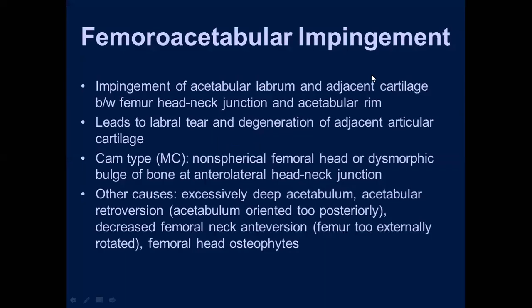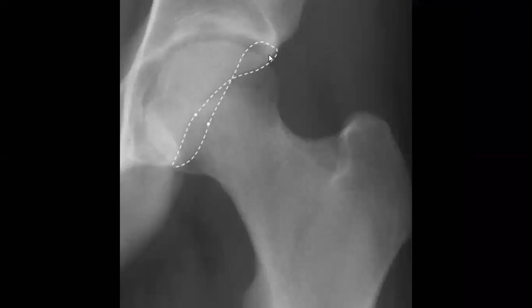We mentioned this one about the types of femoroacetabular impingement, which has cam type and pincer type, right? And when you find the junction between the head and neck foreshortened, there are two types.